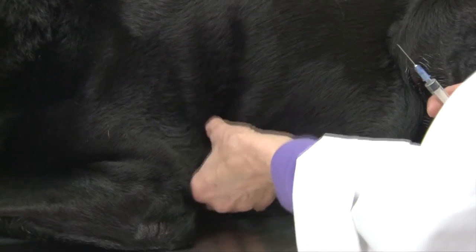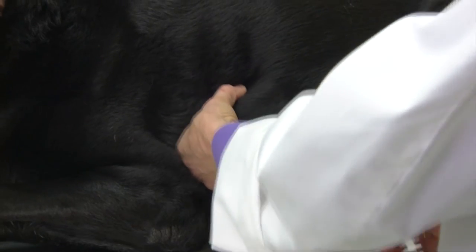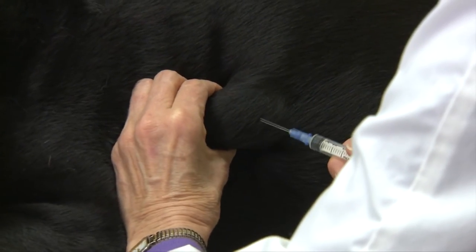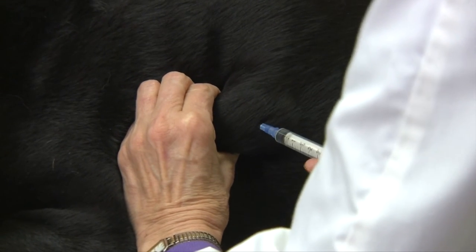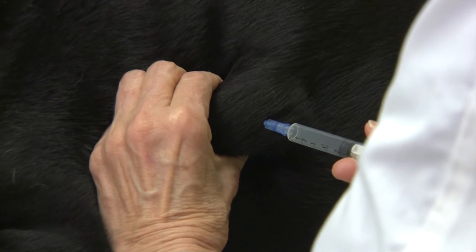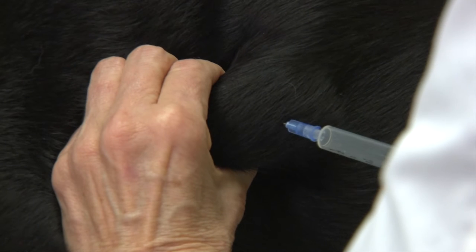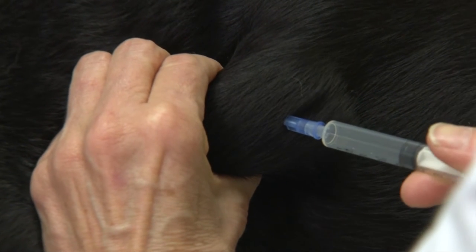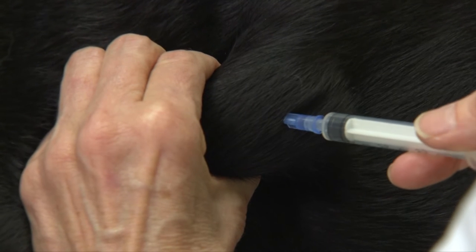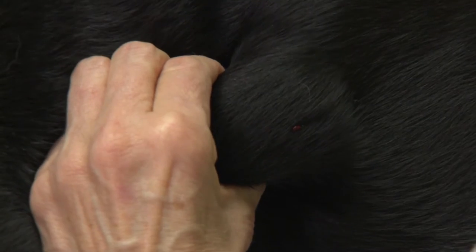You want to immobilize the mass in your left hand — for me, I'm right-handed. We will insert the needle into the mass, then apply as much negative pressure as we can. Then we will redirect that needle within the mass usually two to four times, release the pressure, and then withdraw the whole unit from the mass.